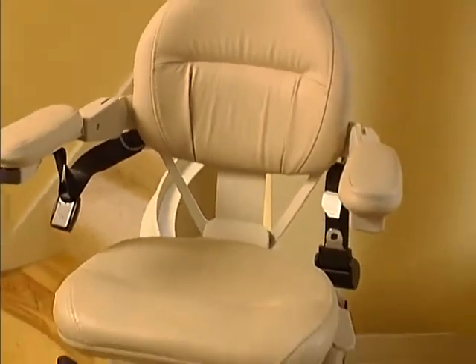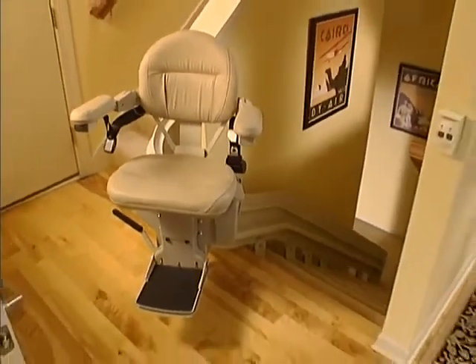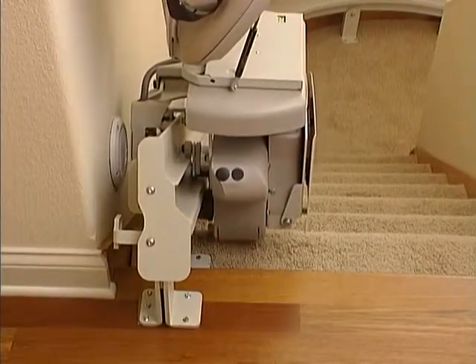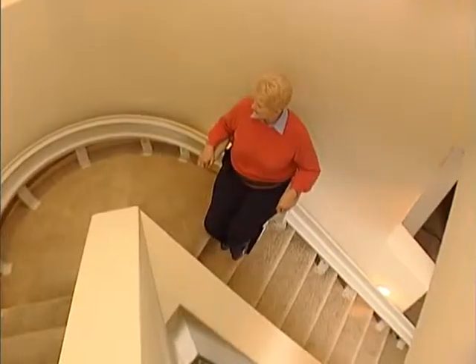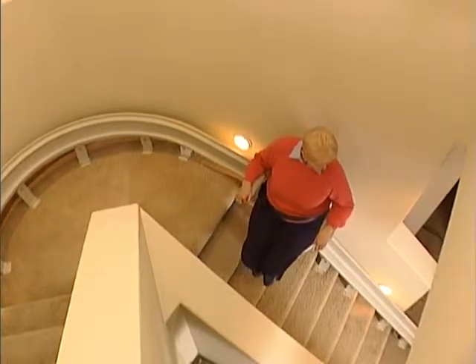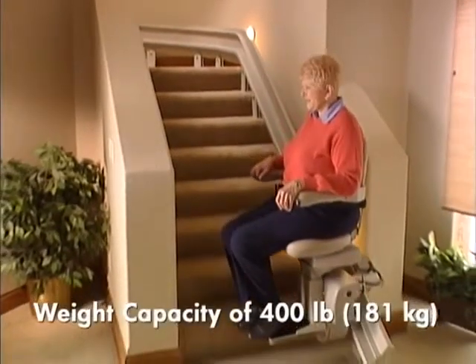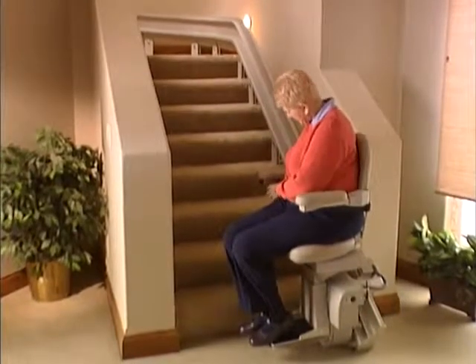While it is undeniably beautiful, the Elite Curve may be even more remarkable for its strength and durability. Powered by two 12-volt batteries that are automatically charged at the top and bottom of the rail by a 2-amp battery charger, which plugs into any normal household outlet. Its smooth, powerful drive system uses a self-locking worm gear and rack and pinion drive. Even carrying a maximum rider weight of 400 pounds or 181 kilograms, its soft start, soft stop feature provides maximum comfort.